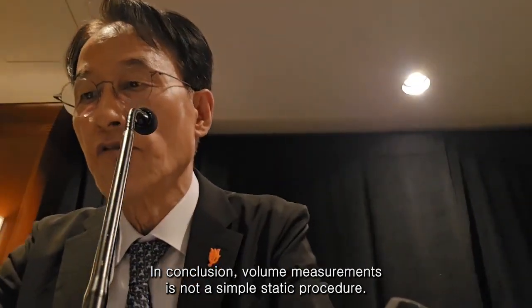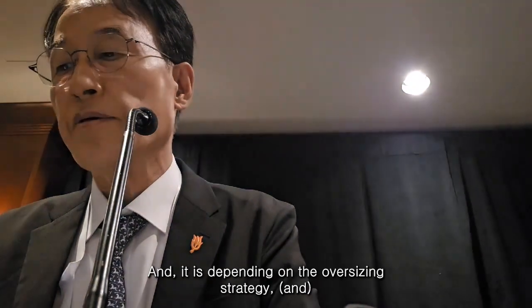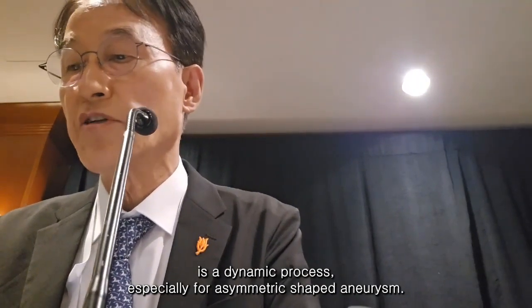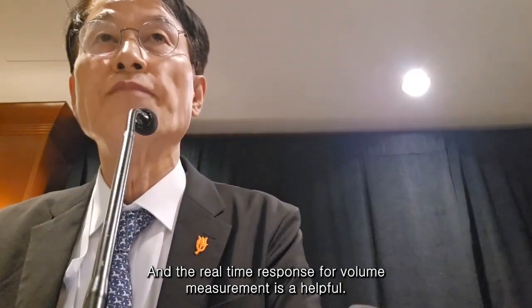In conclusion, volume measurement is not a simple static procedure depending on the oversizing strategy. It's a dynamic process, especially for asymmetric shaped aneurysms, and a real-time response for volume measurement is helpful.